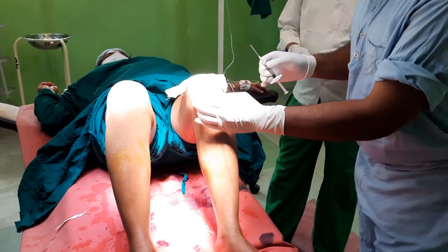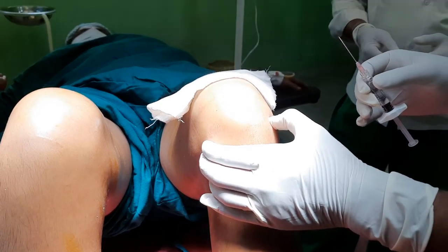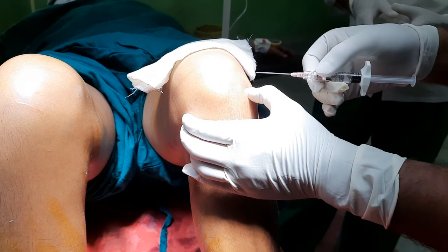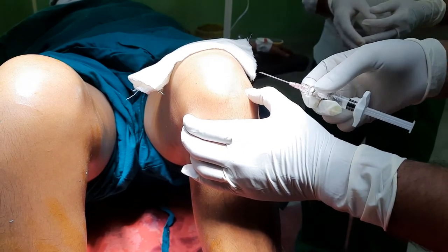In view of landmarks, this is the tibial tuberosity you are seeing, and this is the soft spot — that is the upper border of the tibial plateau. My direction of injection will be through the soft spot, directing towards the notch at an angle of 45 degrees, without damaging the patellar tendon or hitting the femoral condyle.